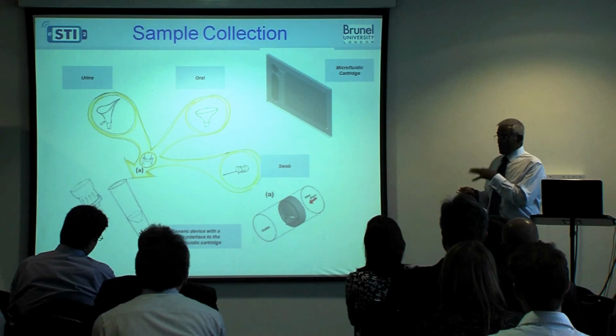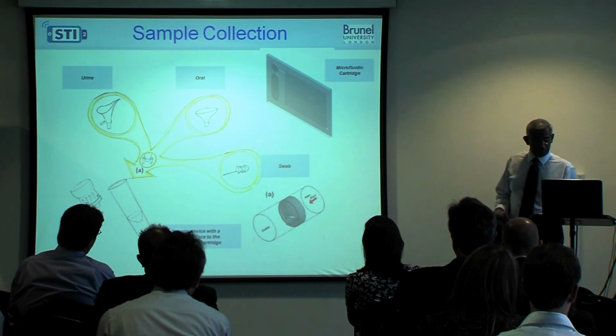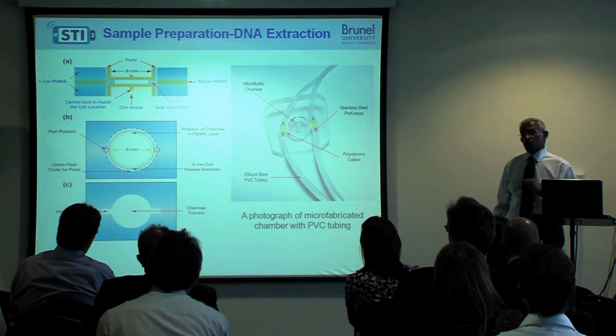Before this project started, we worked on a DNA extraction process using superparamagnetic beads. I'll show you some slides very quickly to see what we have achieved. And we did manage to achieve that within about four minutes.